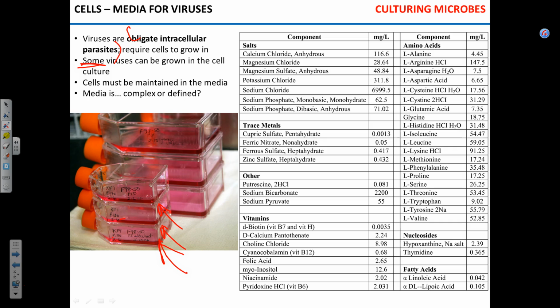You can buy them. I mean, not the skin pieces, obviously. You probably can buy them too. I never inquired. But cells, absolutely. There's a non-profit organization in Virginia that sells it. Okay, you can take a piece of fat, add some trypsin, the enzyme, the protease. It will break down the proteins that attach cells to each other. Shake it, put it on the plate, wait for some time, remove all the clutter, and you're going to have some cells stuck to the surface.